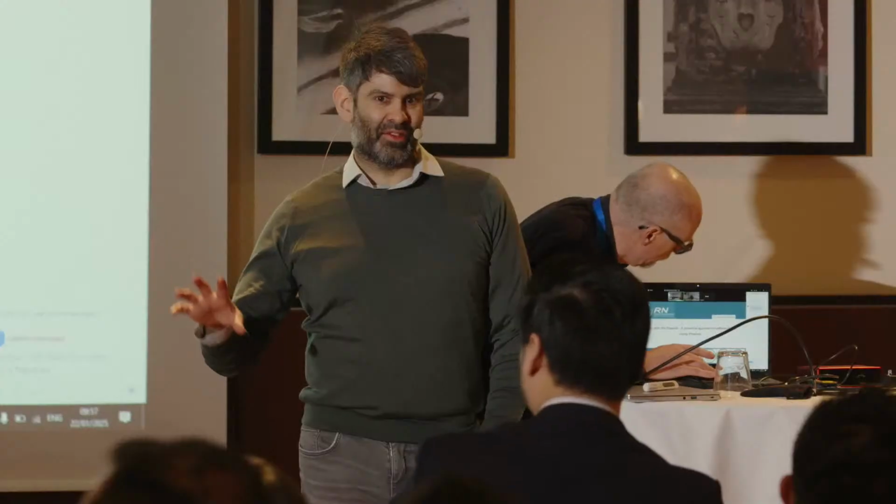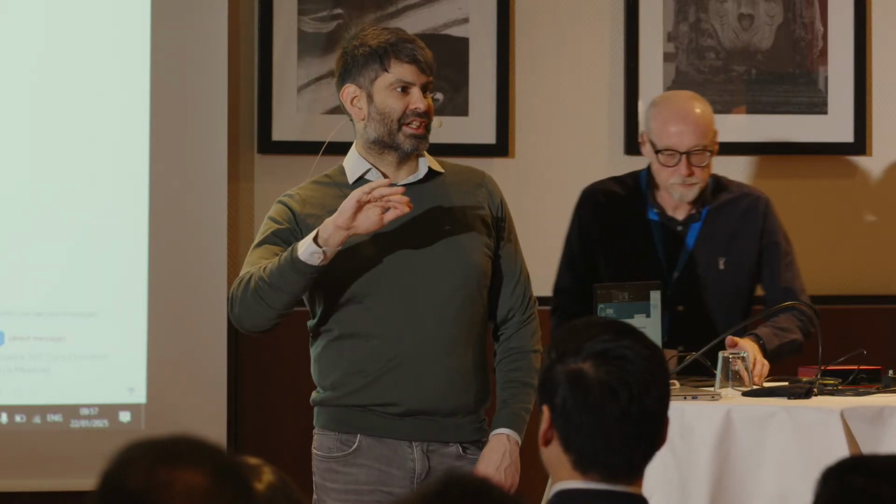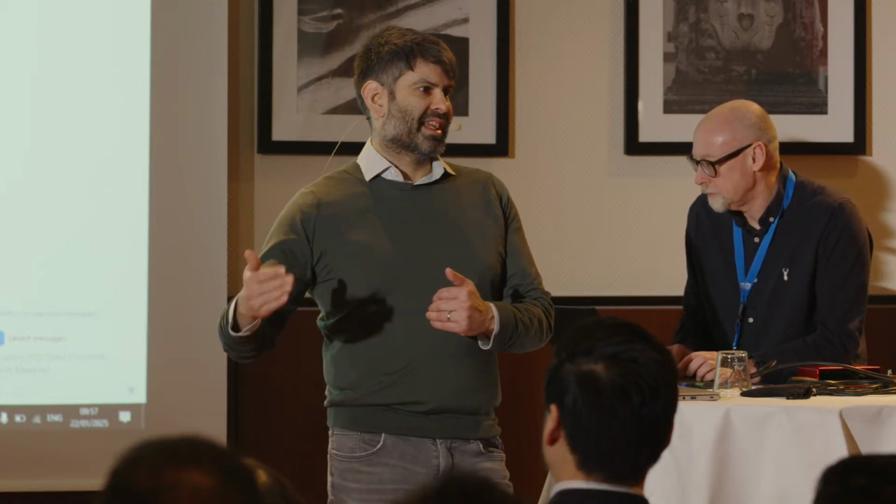Which is that plain balloon angioplasty in a heavily calcified iliac is definitely more sphincter clenching than in the SFA, right? So if you can get that confidence on IVUS that actually we've dealt with the calcium, we've got good enough lumen gain, and now we've got the confidence to avoid a step which brings with it significantly more risk than post-dilating in the tibials or the SFA.